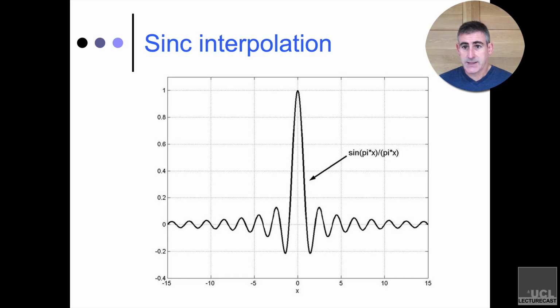The downside of using it is it's computationally more expensive. So back in the late 90s and things, people mostly didn't use sinc interpolation because the computers just weren't fast enough to do it in a reasonable amount of time. Nowadays, that's not an issue at all. On the other hand, sometimes for things like realignment, people still don't bother to use sinc interpolation just because the advantages relative to linear interpolation or even spline interpolation are relatively small with realignment. It'll come into its own a little bit more when we talk about normalization in next week's set of lectures.